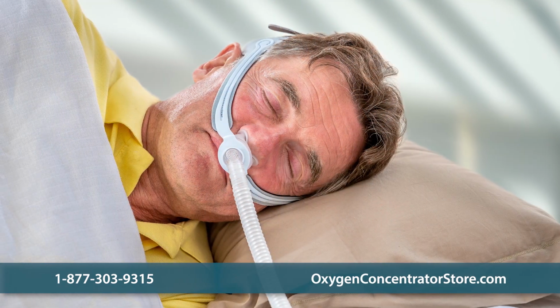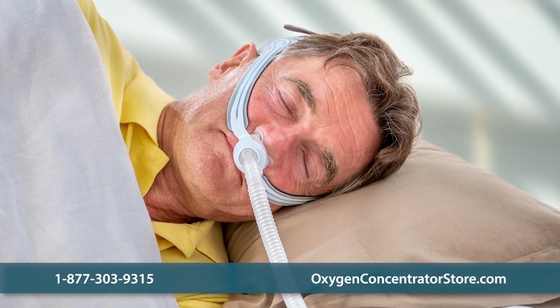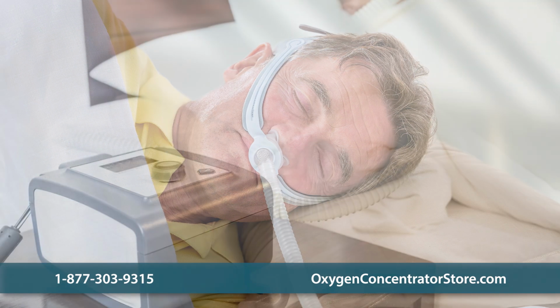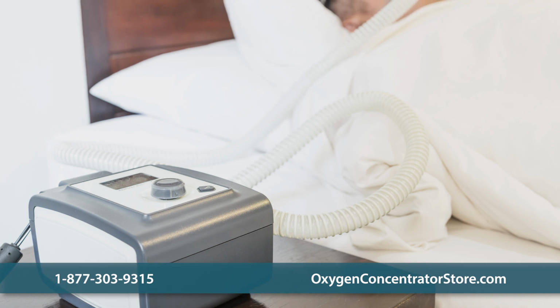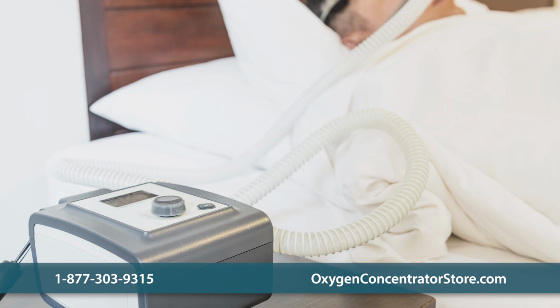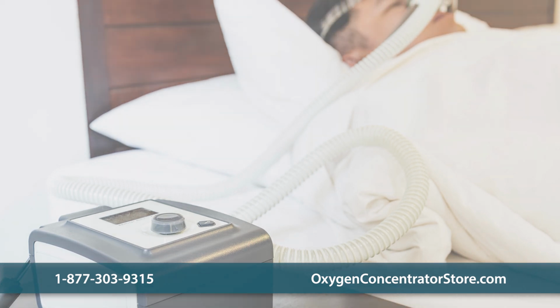If the pressure that holds your airways open isn't being maintained, that will affect your health and impair the machine's sensors and can cause inaccurate event detection. Ultimately, a leak will cause your CPAP machine to wear down faster, and it can also blow air on your face and in your eyes, which is both annoying and drying. So taking steps to fix or prevent these leaks is imperative.